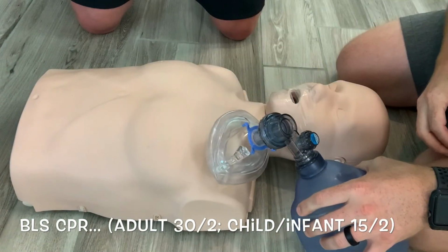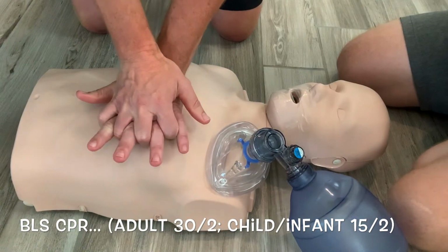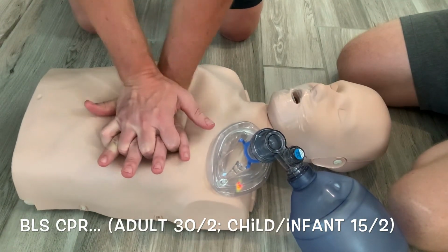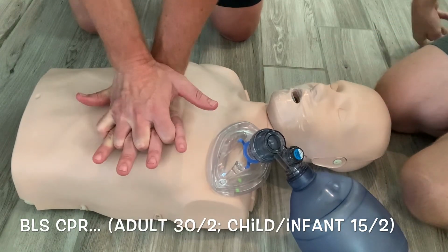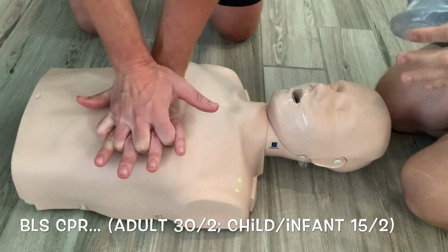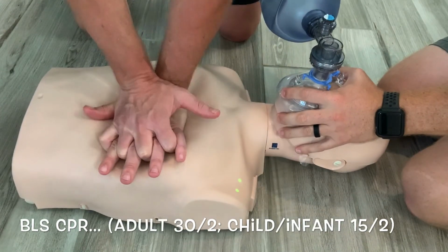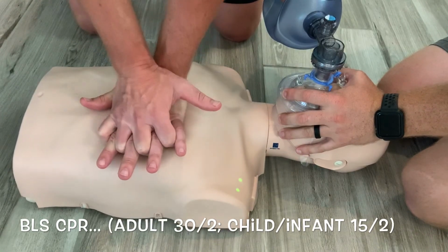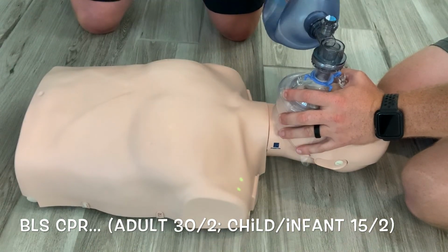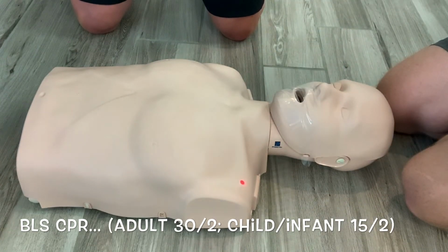Just like any other CPR situation, we're going to start with compressions. 30 compressions, at a 2-inch depth, at a rate of 100 to 120 compressions per minute. After they have performed their 30 compressions, I'm going to perform 2 rescue breaths using the bag valve mask. We would continue 5 cycles of CPR just like normal.